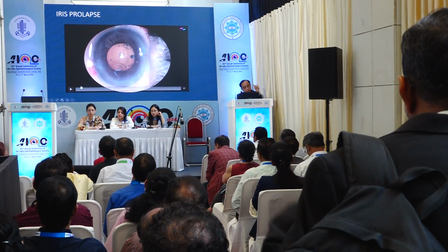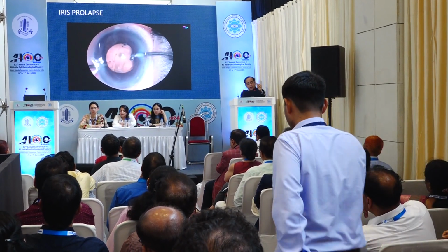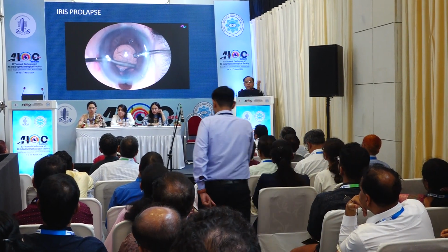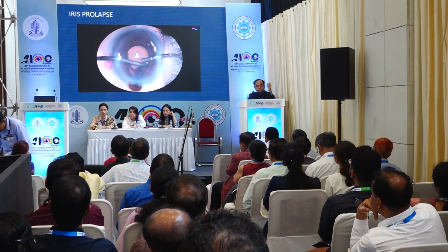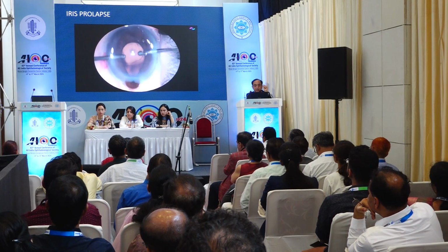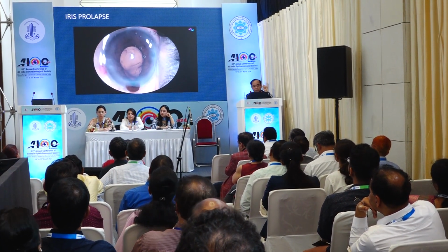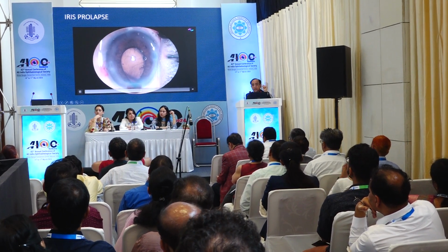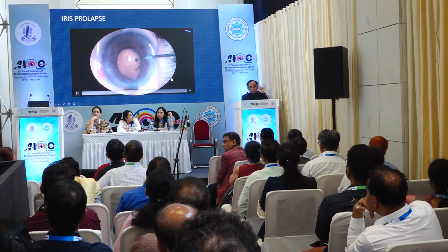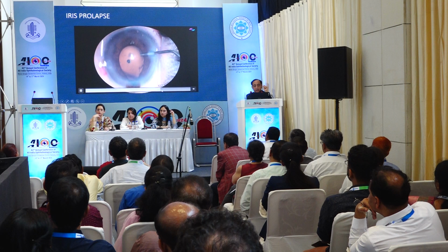Now this is when the iris prolapse is taking place, and if you are at the end of the surgery, you don't have to worry about it because the whole of the nucleus has been removed now, so you don't have to do much. It was a little premature entry, and that's the reason. Otherwise, you should lower all the parameters, and you should deposit this iris preferably not from the same port, but go from the other side and deposit it.